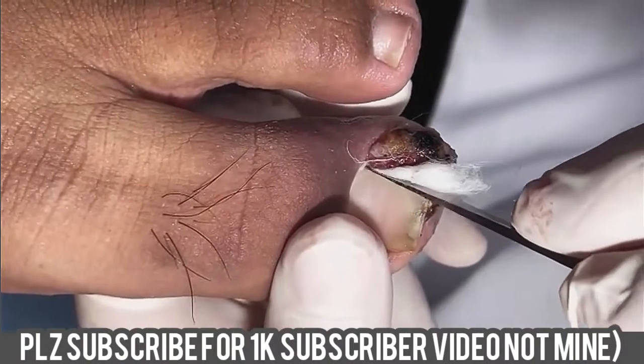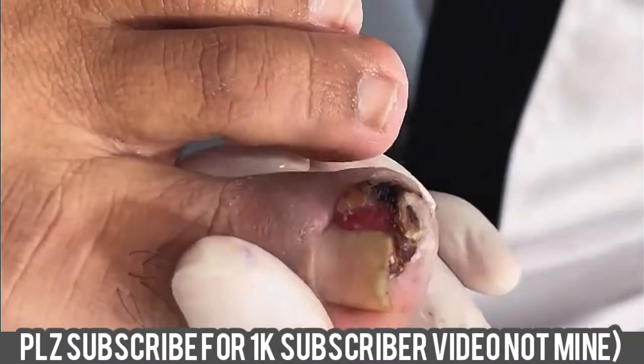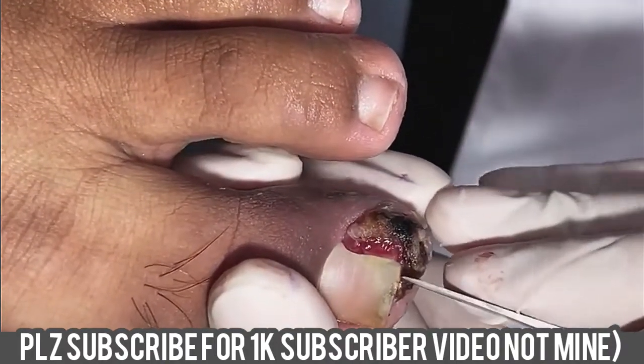Now let us take a look at his right foot. The situation is almost the same, and we also take the ingrown toenail first.